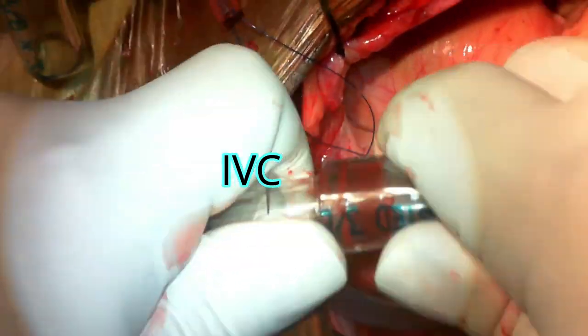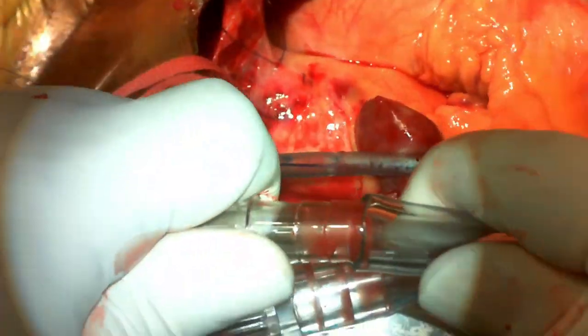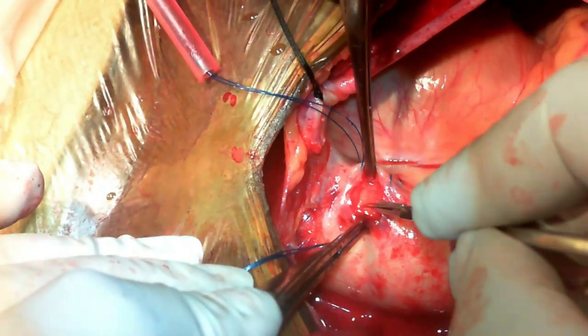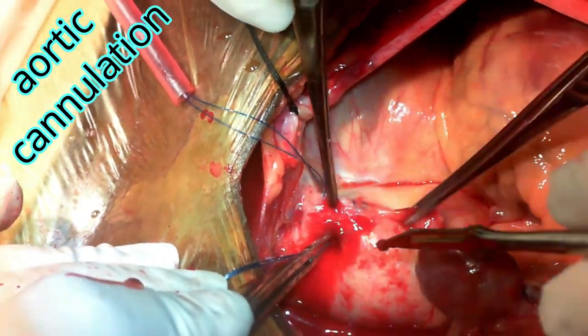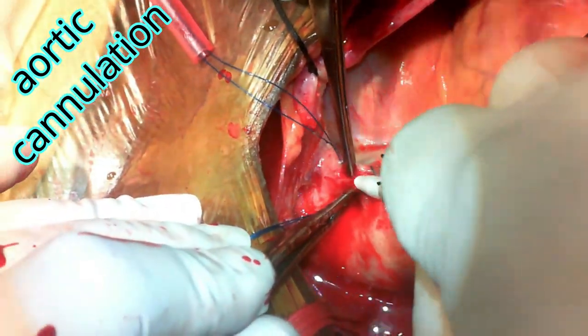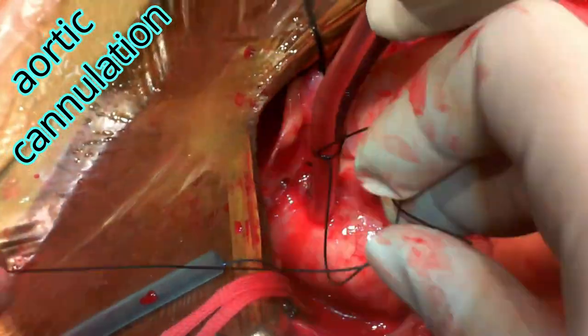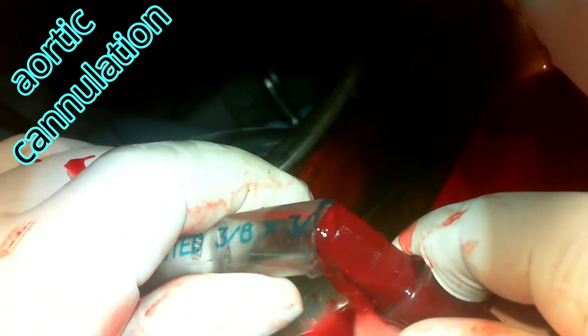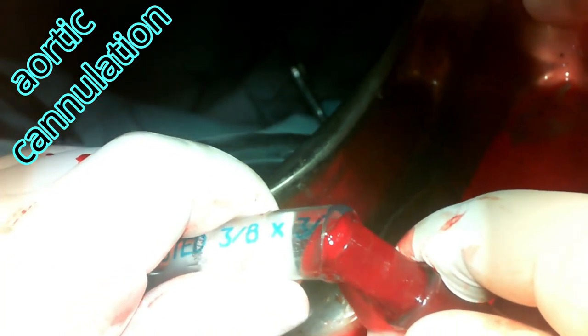Some venous cannulas come with connectors; if not, attach the connectors and be ready. The first step in establishing cardiopulmonary bypass is to perform aortic cannulation. By doing so, you will be able to handle any hypotension from venous cannulation, any atrial arrhythmias that may occur, or hypotension from IVC cannulation — by perfusing through the aortic cannula in situ.